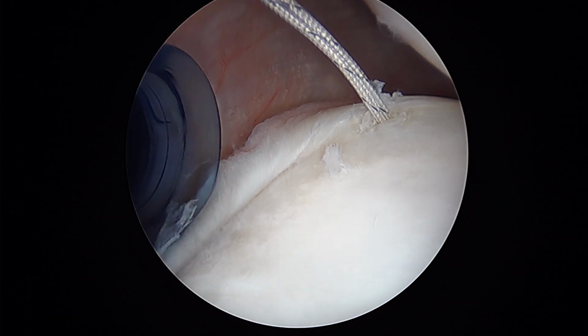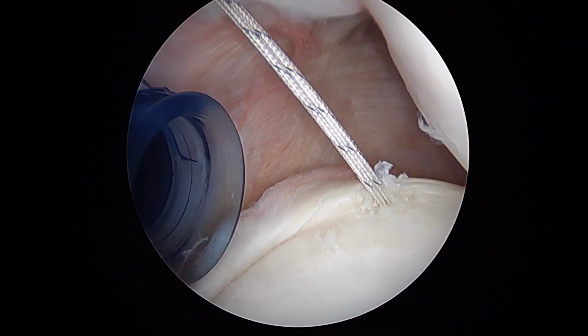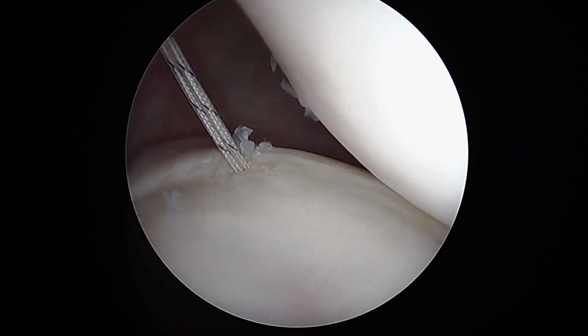And there you can see the two sutures. We'll pull back on because that seats the anchor, and that's very good. So now we're going to pass these sutures around. We're going to take one out the front.